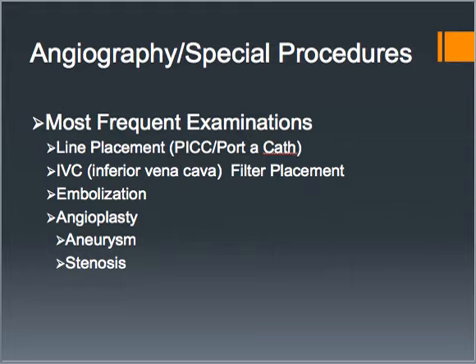Portacaths are a little bit different, similar concept, but they're a small medical appliance that's implanted or installed just right beneath the skin. You can feel it through the skin. And then a catheter connects the port to a vein. So they can be used to draw blood, give the patient IV fluids, drugs, or blood transfusions. They can stay in place for weeks or months. And the same thing, they're to avoid repeated needle sticks. A lot of times, cancer patients will have portacaths put in. That way, when they need their chemotherapy or they need drugs or anything like that, they can give them right through that, and they don't have to needle stick them every single time.